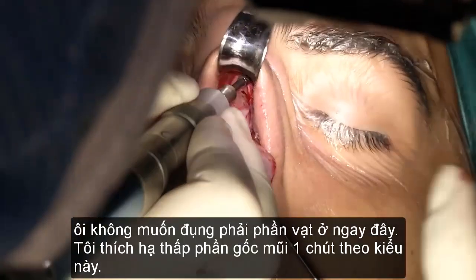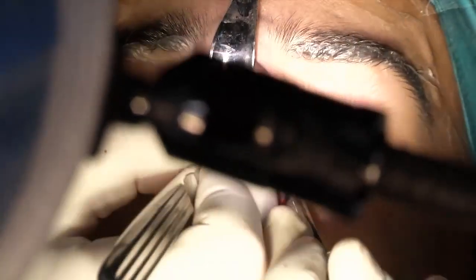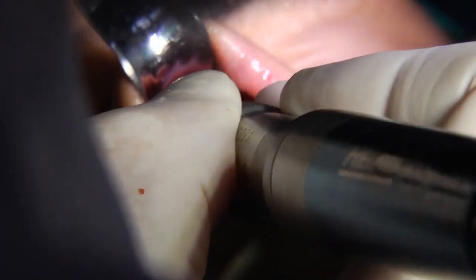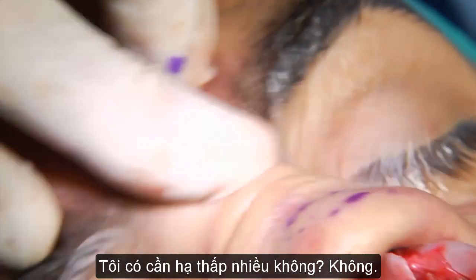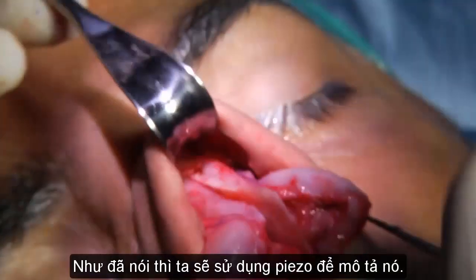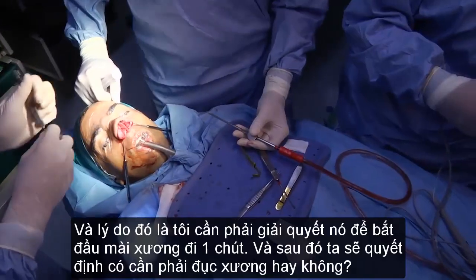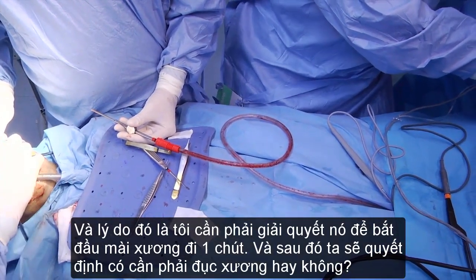So I don't want to catch my flaps here. But I like this way of lowering the radix just a little bit. So, do I need much of this? No. But I thought, looking at him on the profile, that I may need to deepen his radix just a tiny bit. Having said this, let's go to the piezo, for demonstration. And the reason is I have to begin some osteoplasty work, and then we'll decide if we want to do an osteotomy or not.